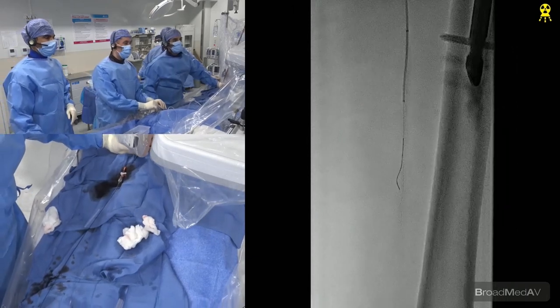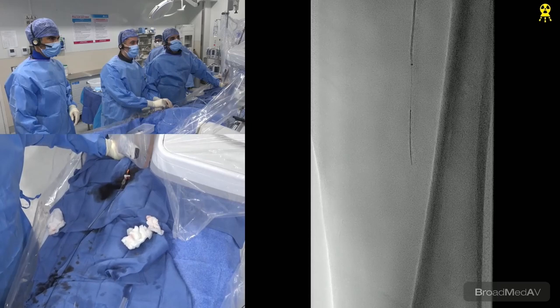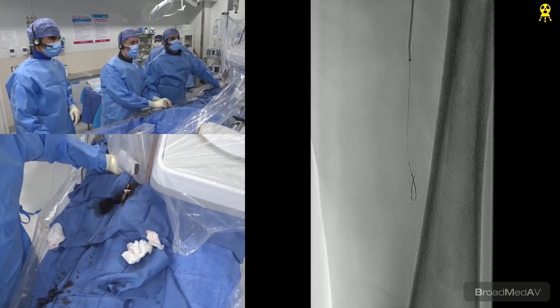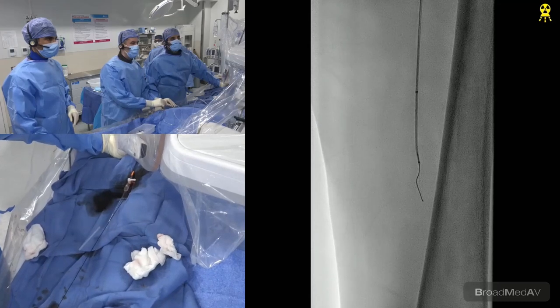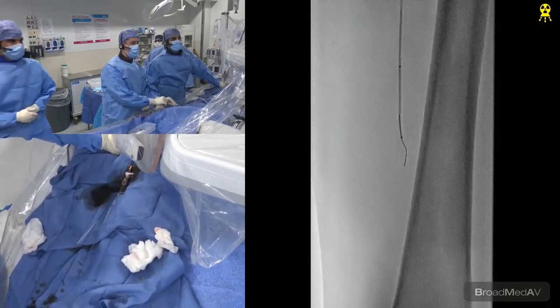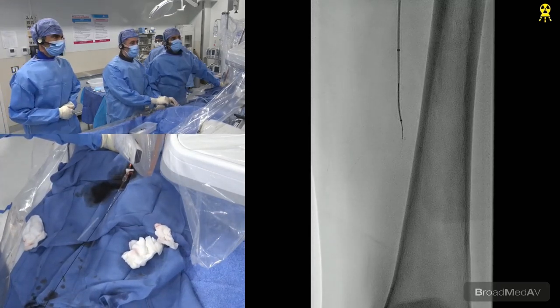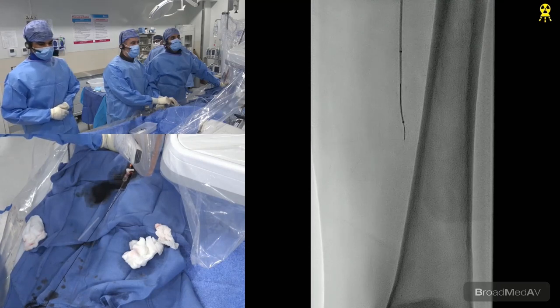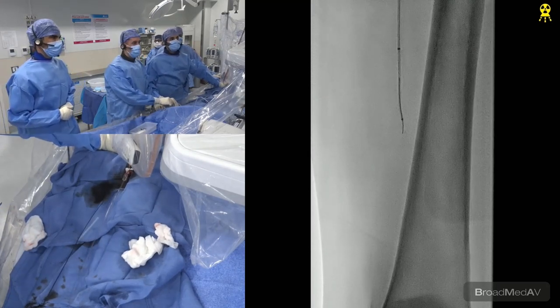I mean, he's going to try with an 014 wire. And I think the choice of wire should be an 014 here because of the fact that you had such a short segment. You'd like to stay intraluminal. And I think Vishal already is intraluminal. Oh, there it is. Oh, don't loop it. So now Raman's going to come down, and then he's going to try to just cross it with the tip of the wire. So if Raman gives enough positive pressure here, like any CTO, it is going to cross. The only question now is, what do you treat and how do you decide what to treat?